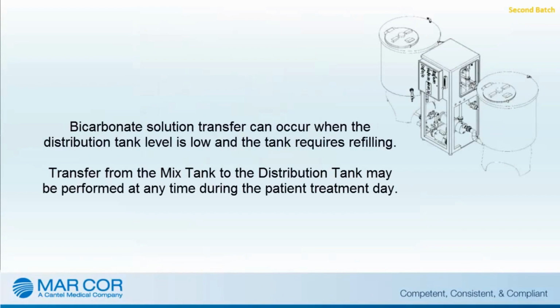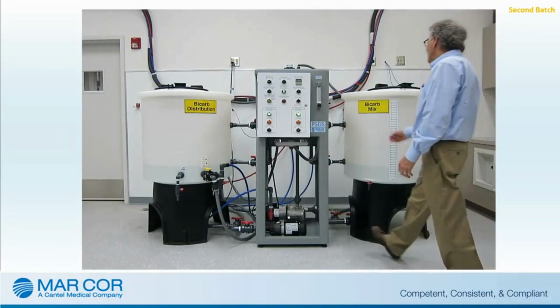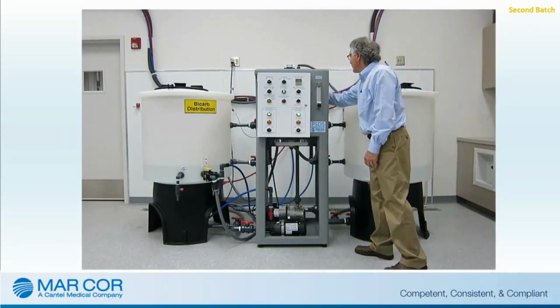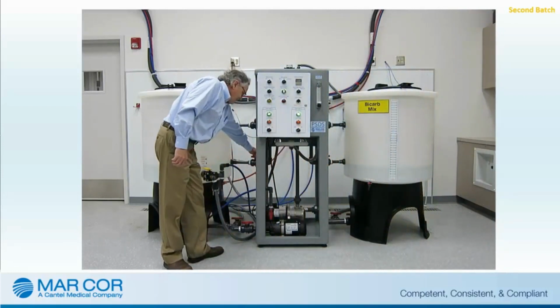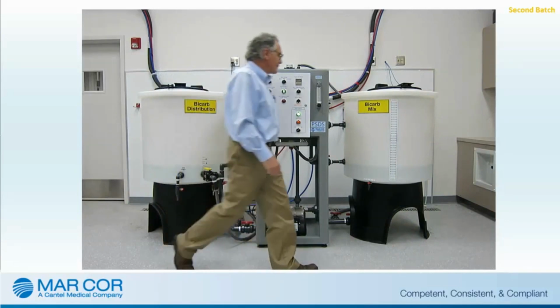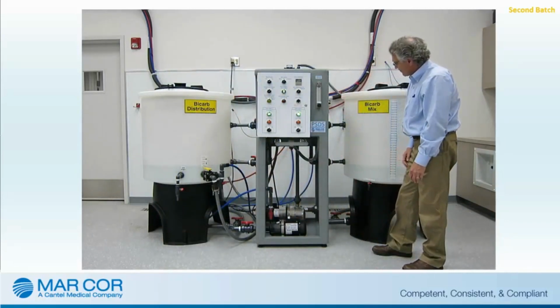Bicarbonate solution transfer can occur when the distribution tank level is low and the tank requires refilling. Transfer from the mixed tank to the distribution tank may be performed at any time during the patient treatment day. The bicarb solution in the mixed tank can then be transferred to the distribution tank. To perform the bicarb transfer procedure, the operator will need to ensure that the valves are in the correct positions and the mix pump turned to the transfer position.